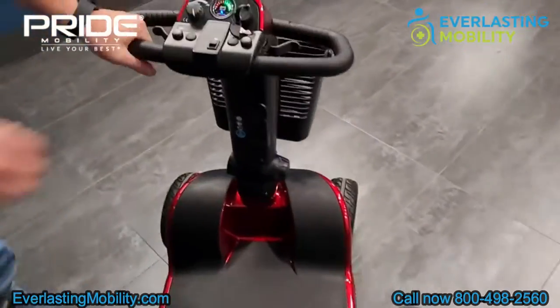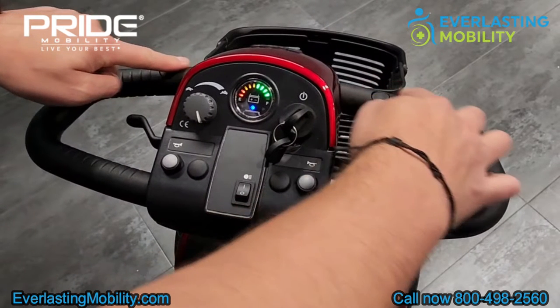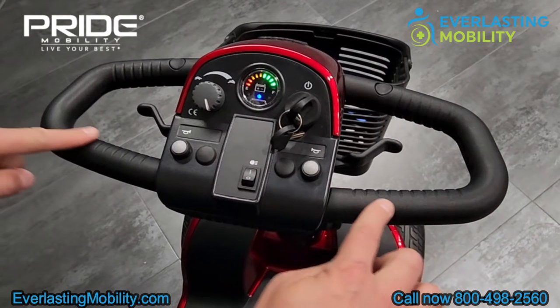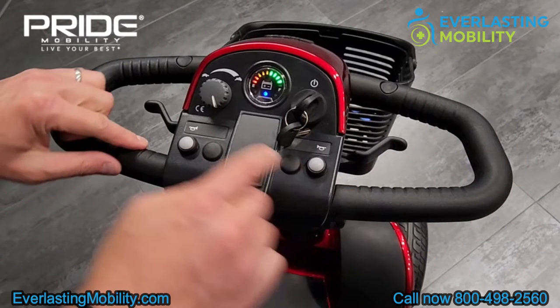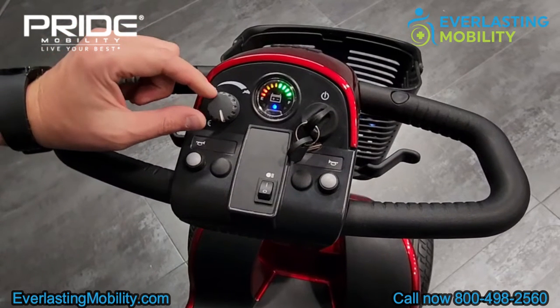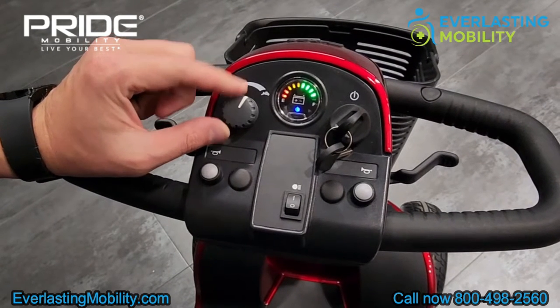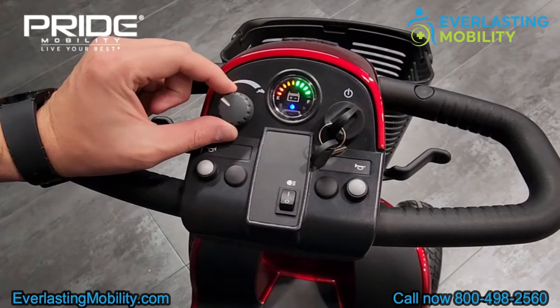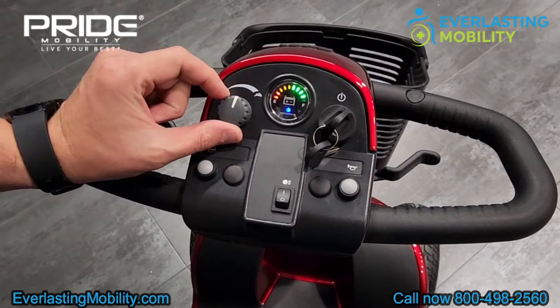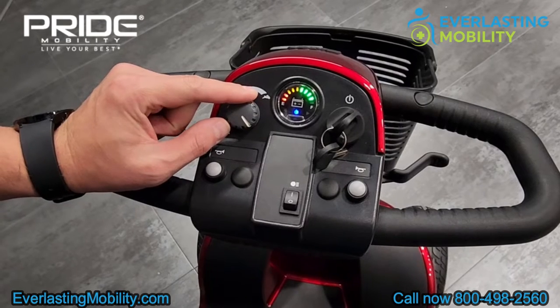On the tiller, it comes with two keys and has a delta tiller. If you have limited dexterity in your hands, the delta tiller is nice because you can rest your wrists on the bar closest to the driver and use the two throttle pod levers to accelerate. This is your battery gauge, and to the left is your speed control dial. Turn it all the way to the right towards the rabbit to reach max speed of about 5.3 miles per hour, or all the way left towards the tortoise to cut speed down to about 2.5 miles per hour — useful when traveling through stores or around crowds.